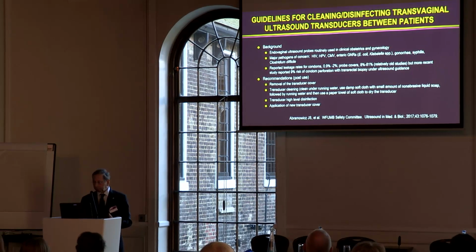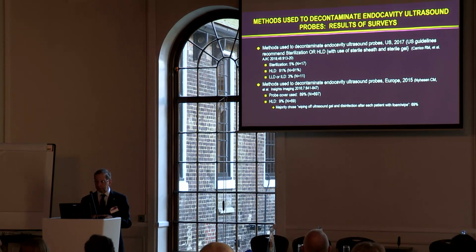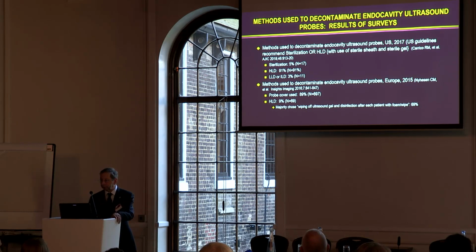I'm going to skip this and just go on. Methods used for decontamination of ultrasound probes, recommended sterilization, disinfection. In a survey, even in the U.S., where we recommend, by the way, high-level disinfection or sterilization, you can see most people do it, but we still had, in a survey, 3% of people not doing it, unfortunately.